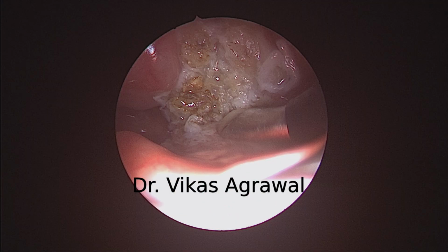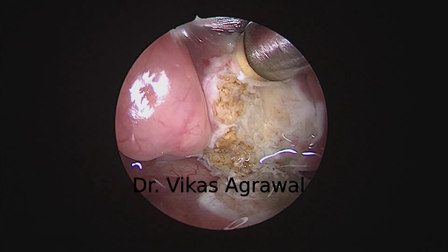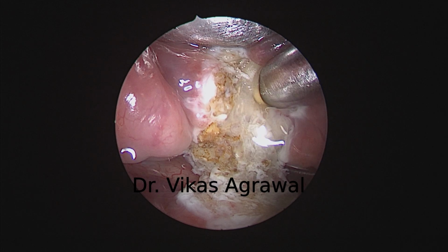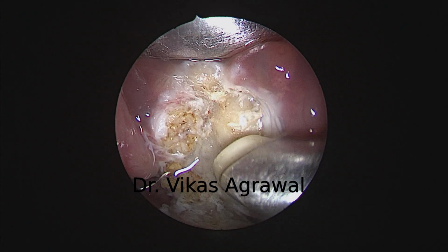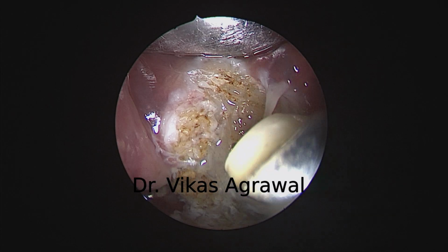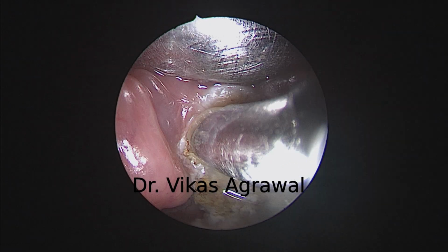I am not going too much laterally. This area is not causing the problem. So if you want, you can remove this lymphoid tissue by ablation. You see this? If you see too much of it, you can remove it by ablation. But be very careful while ablating, because that's when you are not coagulating the vessels.